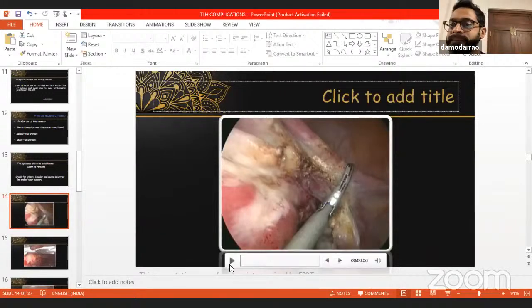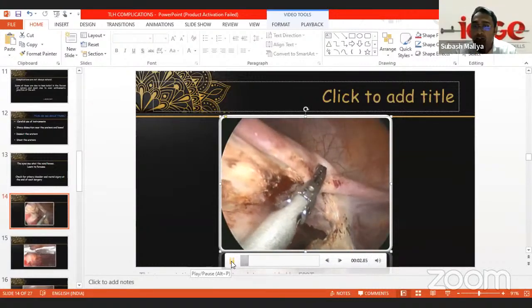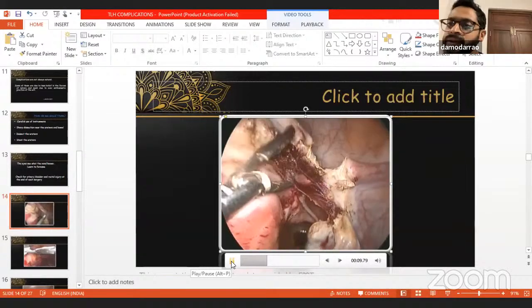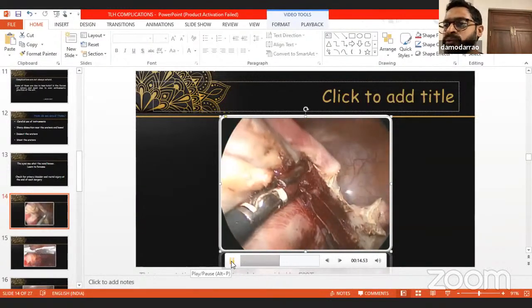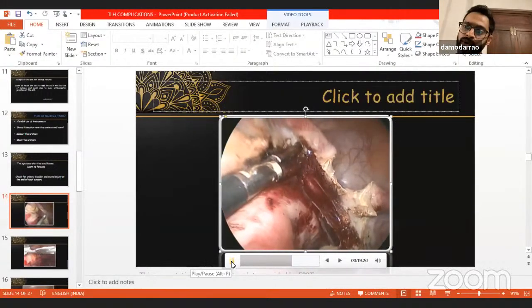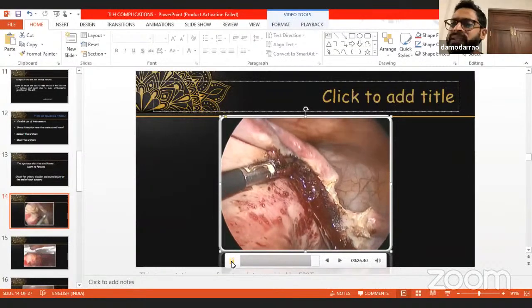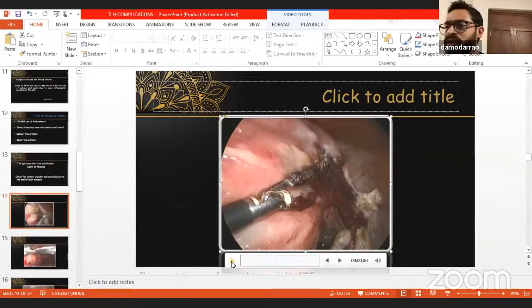Yeah. Is it a picture or is it? And as I would always say, you have a problem like, this is not a complication per se. How do you avoid the mistake that I've done here? Yeah, basically you have to try and not cut on the uterus as such. Stay away from the uterus. Like in your open surgery, like you told, not to go too much on the uterus, and then you stay away, and then you can avoid this backflow. No, it is not a complication. It's not a complication as such, but it's going to be troublesome for you to operate.